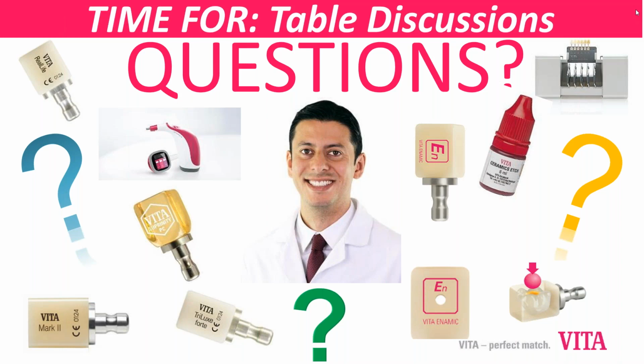Yes, there's a very classic article by Dr. Rosenstiel from Ohio State University, and he explained that in less than a millimeter, you have a limitation to go from, let's say, extreme situations, right? As I said before, from a C4 to a B1 in 0.7. It's not going to happen all the time. Okay, what we need to understand is that we need material thickness to be able to manage those more extreme cases.